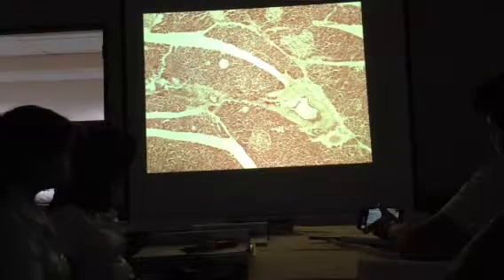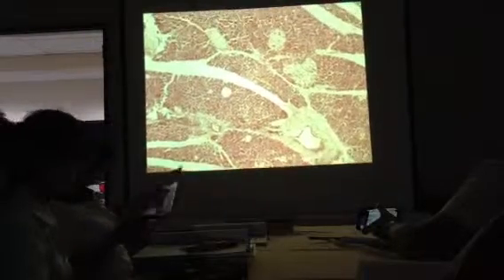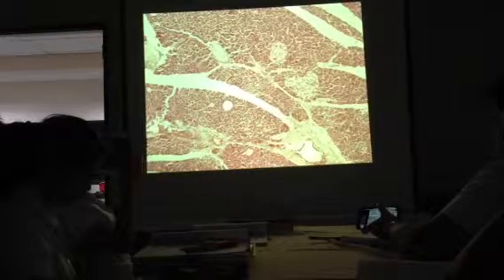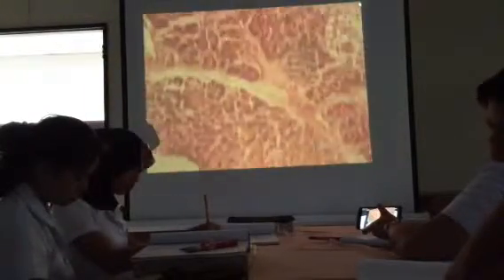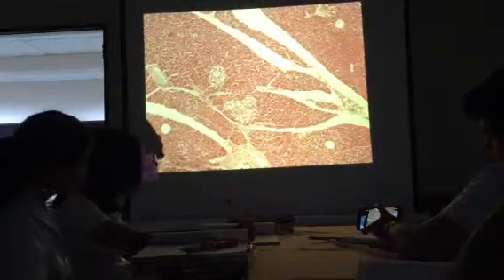Areas inside the lobules which have lighter staining. Okay, it is where the cells responsible for producing insulin, glucagon, somatostatin are located. Those are better appreciated in low power. They are called the islets of Langerhans.